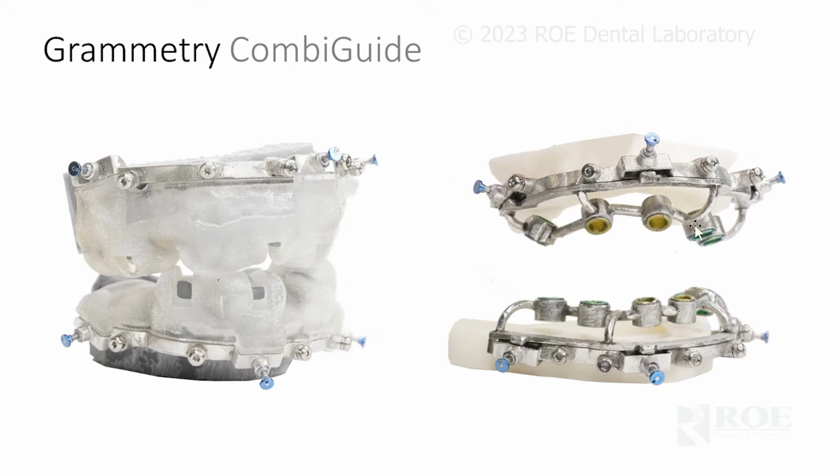This metal stays in the mouth, and then you use this as a bone reduction leveling. Then you use an osteotomy guide. What this allows you to do is pre-plan for bone reduction volume. We have to know that the adequate amount of bone is reduced for the prosthetic thickness. Then your implants are controlled: rotation, depth, MUAs are in a nice place. You've worked out the AP spread. It's a nice way to go. So probably about half and half right now, guided and freehand.